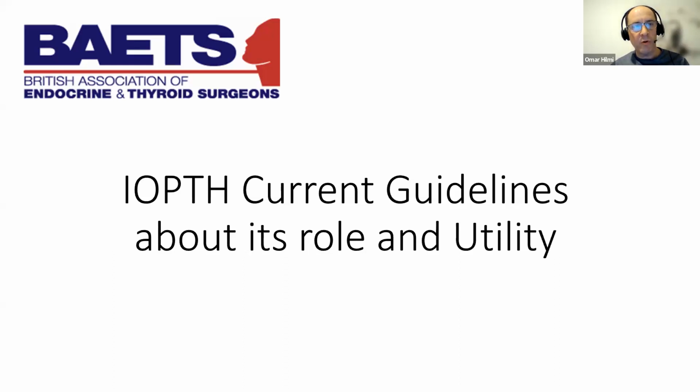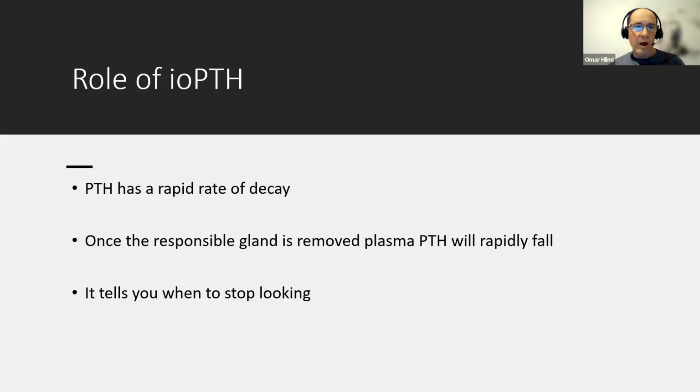Or do we need to be doing more four-gland explorations? As I said, very successful operation and in good hands, very few complications. But we need to strive to do better. And that's where intraoperative PTH monitoring can help. Now, there's nothing new about this technology. It's been around since the 1970s.